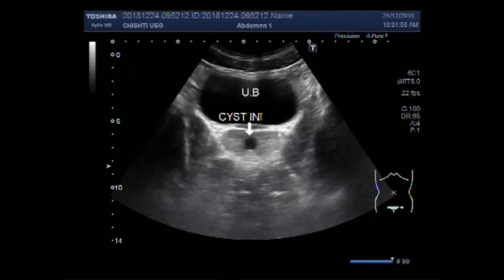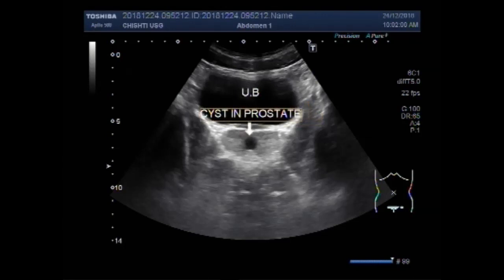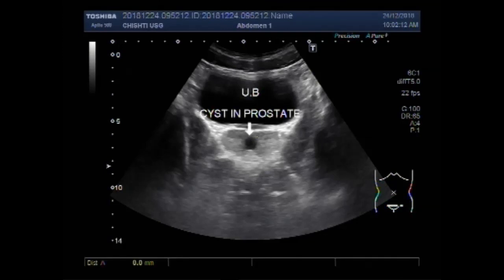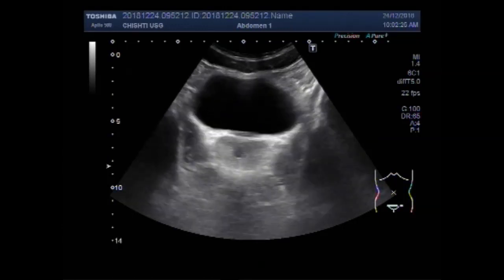Prostatic Utricle Cyst is an area of focal dilatation seen within the Prostatic Utricle. These cysts are midline cystic masses in the male pelvis and can be very difficult or impossible to differentiate from Mullerian duct cysts. You can see the cyst measures about 13mm to 12mm.